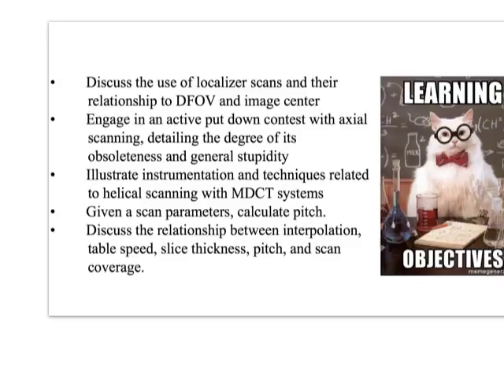So where X-ray technologists learn about positioning and procedures all day, and maybe radiation therapists, we learn about different kinds of setups and how those could be used for different kinds of cancer treatments. CT tech, what we really spend a lot of time thinking about is scan coverage, slice thickness, pitch, table speed, as well as contrast injection.